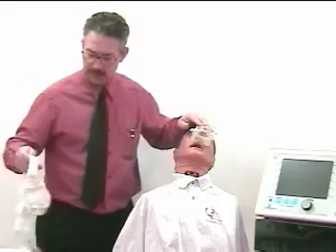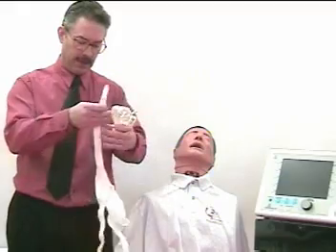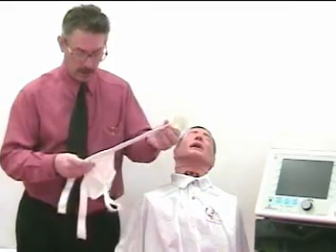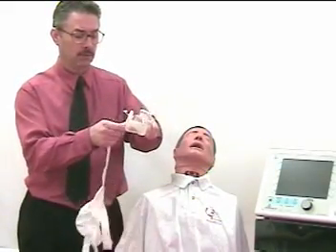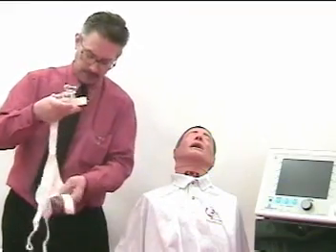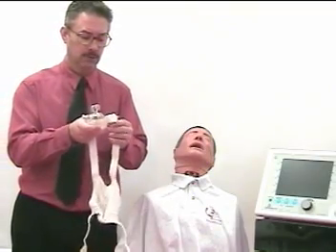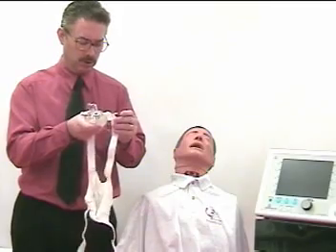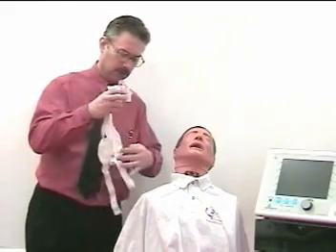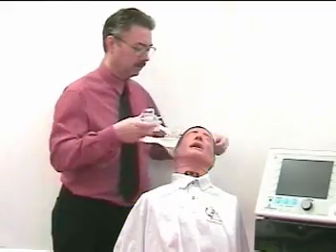Next, you will attach the bonnet to the mask. Make sure you identify the top and bottom of the mask, and it's best to connect one portion of it, one side, so that it makes it easier to go onto the patient without slipping and falling. As I'm doing here, I'm placing just the straps to one side. These bonnets are all different, so you may have to read instructions to make sure you know the specific fit.